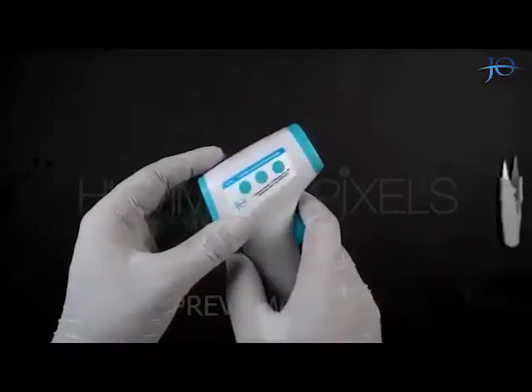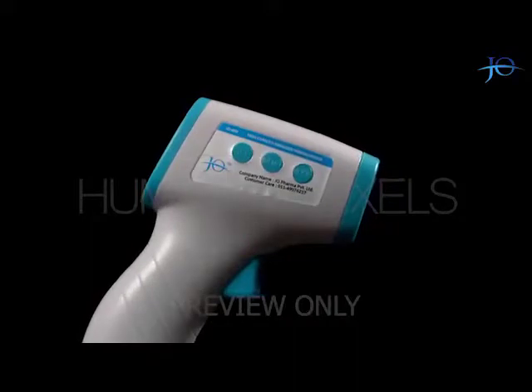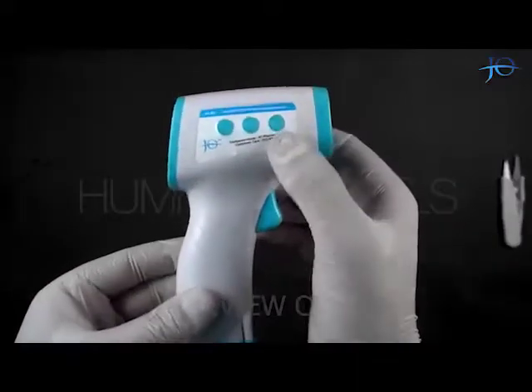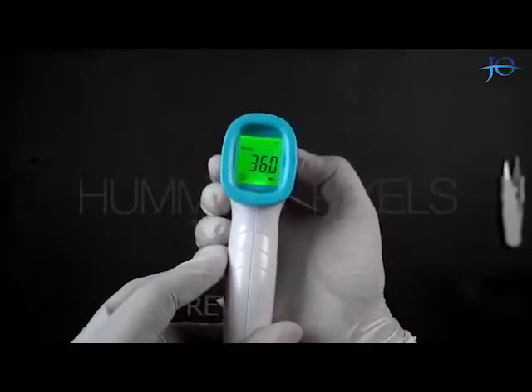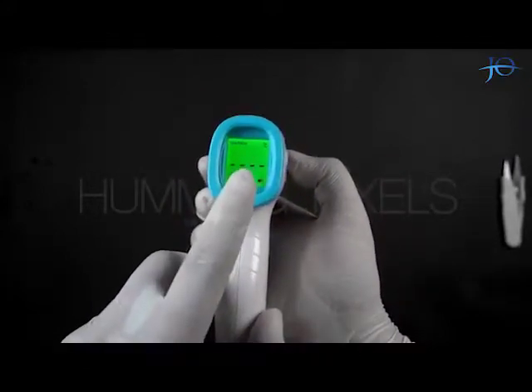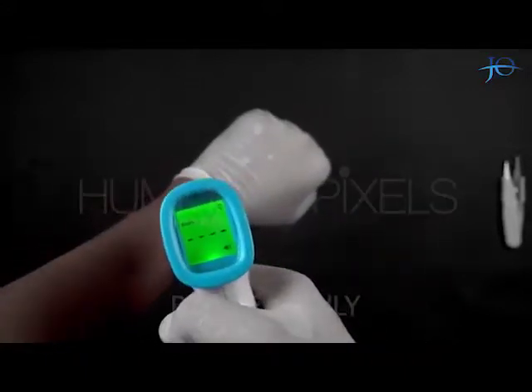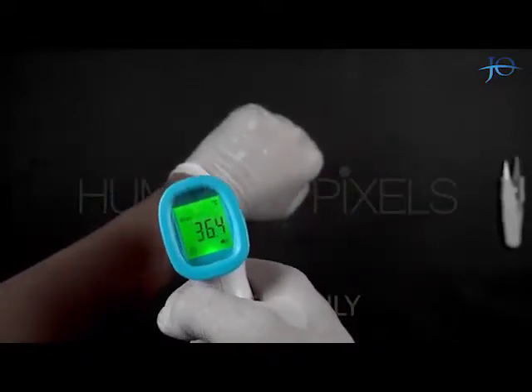By pressing the trigger button, the gun gets turned on. The gun has three buttons on one of the sides: Set, Memory, and Mode. By pressing the Mode button, we can choose between body mode and surface mode. When we press the trigger, the screen indicates the temperature of the body or the surface, whichever was selected.